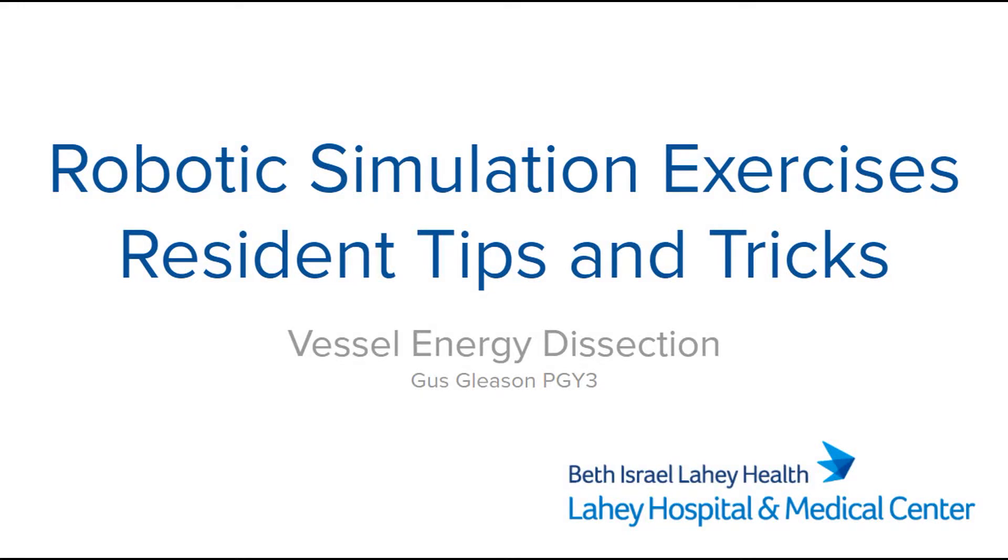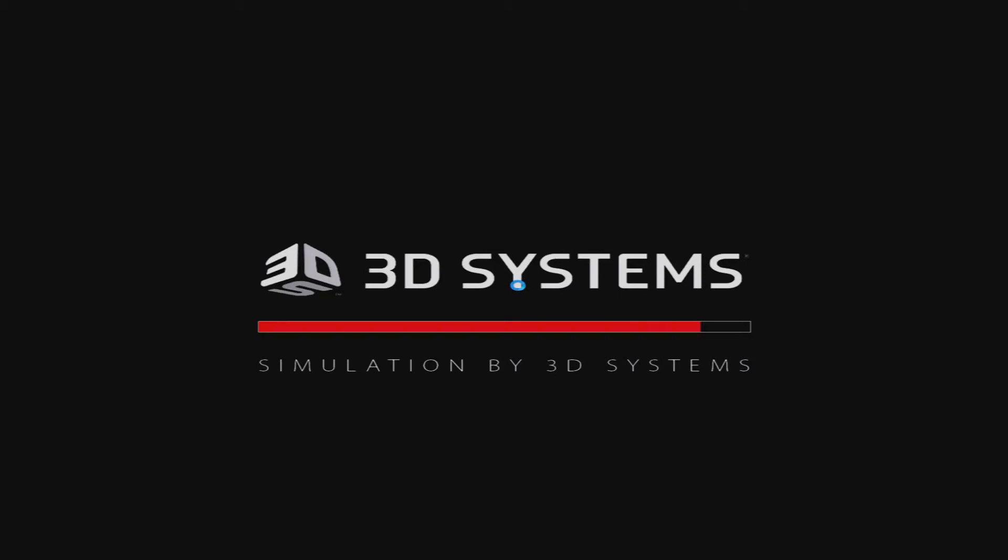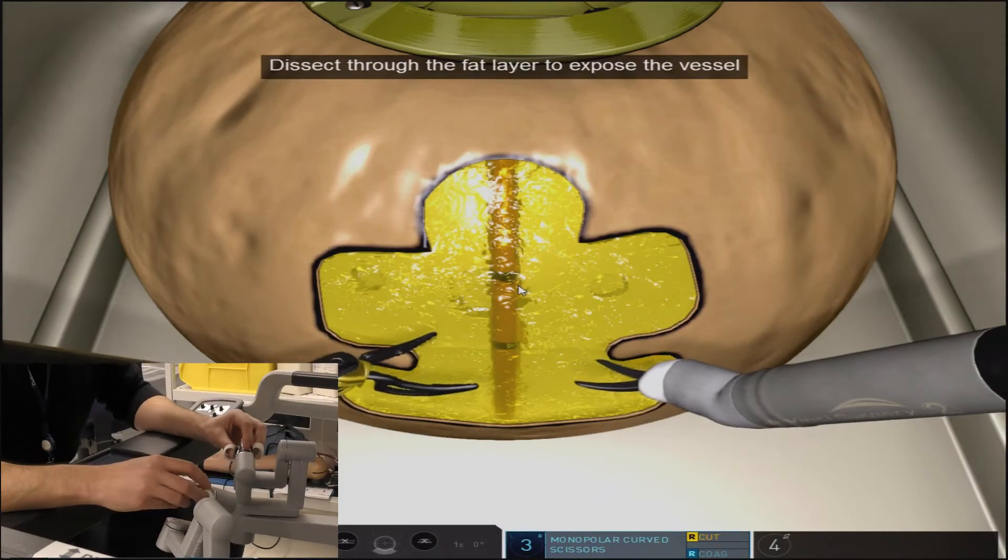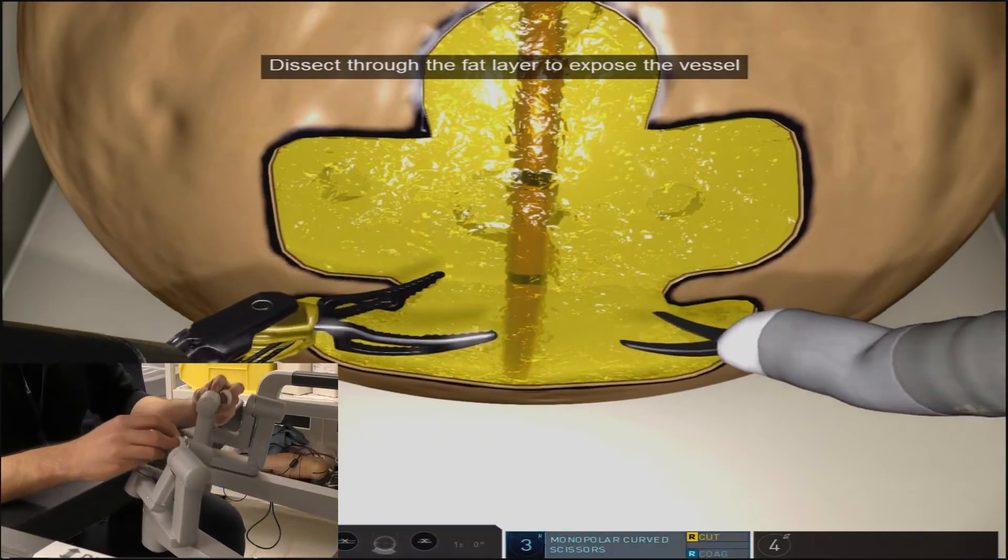Vessel energy dissection is a simulated tissue exercise which requires you to dissect out a vessel, coagulate at two ends, proximal and distal, and transect in the middle of those coagulation points.